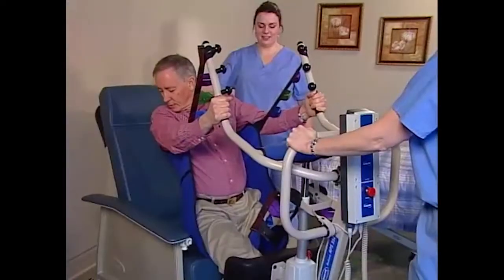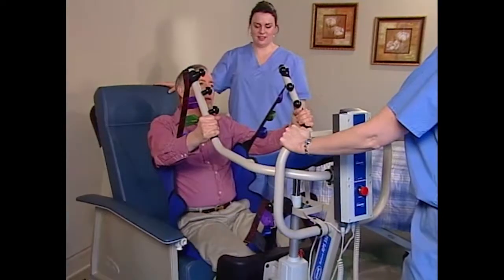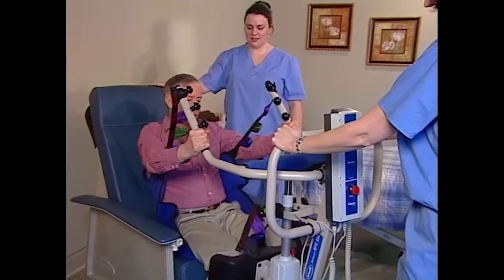If you explain each step as you work through it, your resident will learn the routine and become comfortable with it. Watch as we position a transport sling for a resident transfer.